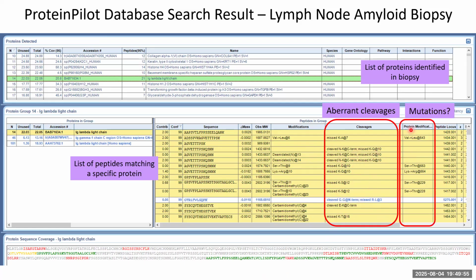Additionally, you can allow the software to look through and perform in silico mutations of all these entries. And that's how we often get more matches to the antibody sequences that we don't actually have in our database. We tell the software to do in silico mutation on the fly while it's searching and allow up to 2 amino acids per peptide to be switched for any other 2. So that helps us spot things that aren't actually in our database but exist in the patient.